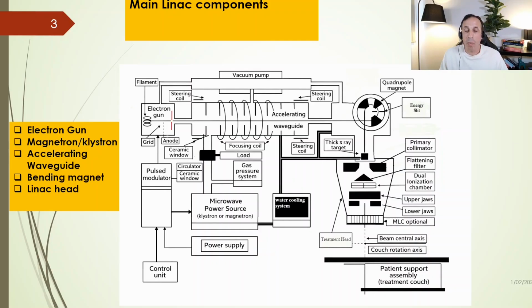In another slide I will explain how the acceleration happens inside the accelerator waveguide by the radio frequency waves. It is a very important concept. We should talk about it.